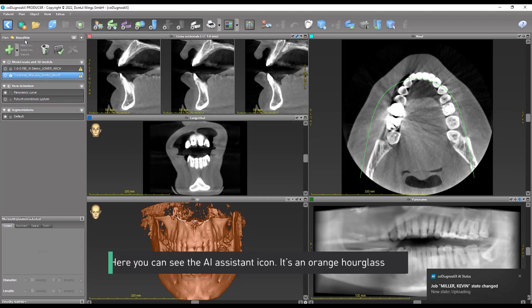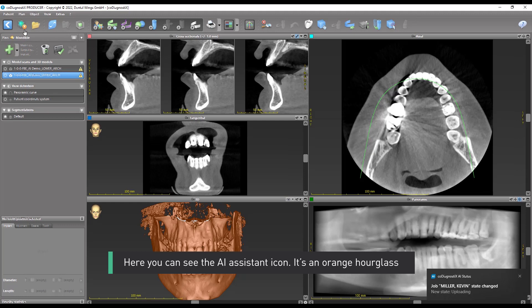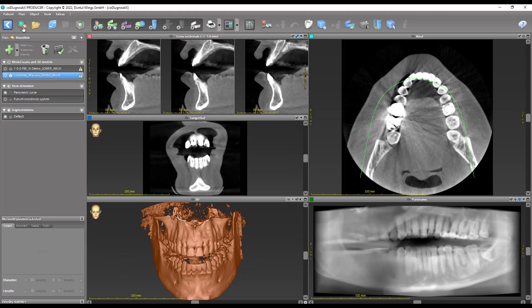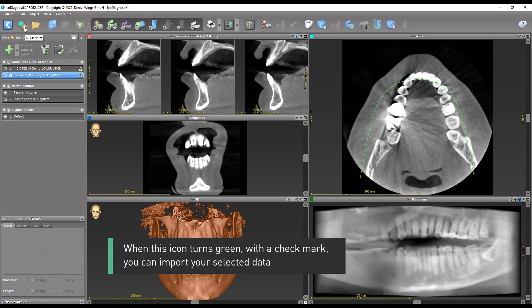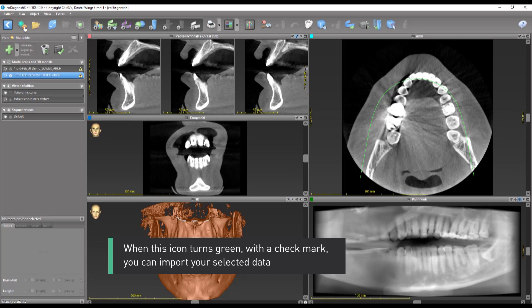Here you can see the AI assistant icon. It's an orange hourglass. When this icon turns green with a check mark, you can import your selected data.